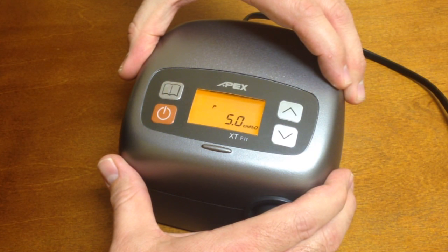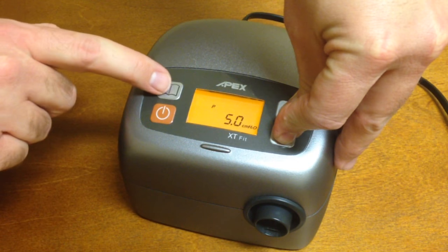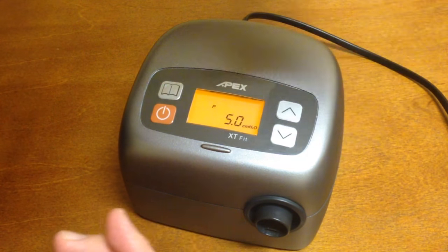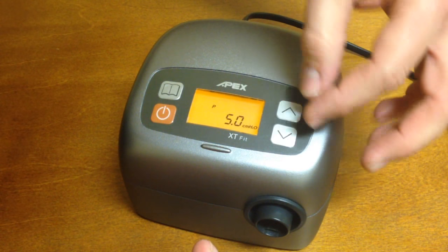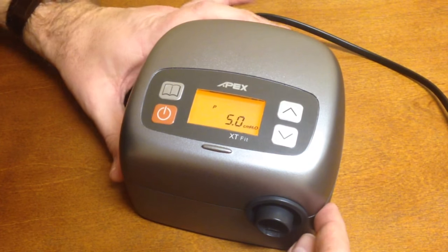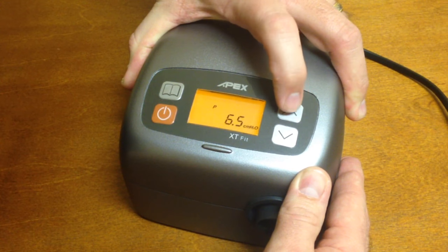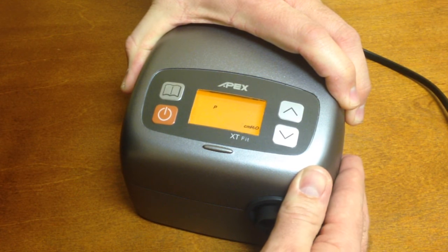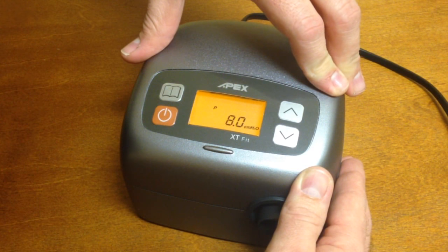This is done slightly different. You have to not only hold the two arrows at the same time, but then you need to press the book button. If you do it too quickly, it won't start flashing — just try it again and hold those down a little bit longer. Keep holding them down while you press the book button. Once the pressure is flashing, you can change the setting to the desired pressure — in this case, eight. Once you have the desired pressure set, press the book button again to set that pressure and you're all done.